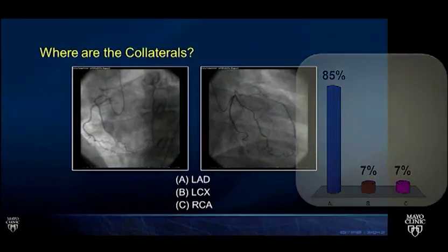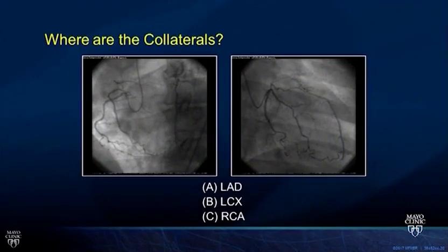Excellent. So this is an angiogram where the right coronary is being engaged and injected. This is the LAO view. Spine is to the right. Ribs are going down to the left. So you can see the right coronary filling, and you see collaterals coming from this acute marginal branch and also the distal right coronary and coming over to where the LAD should be in the LAO view.